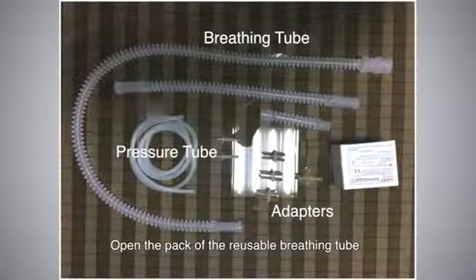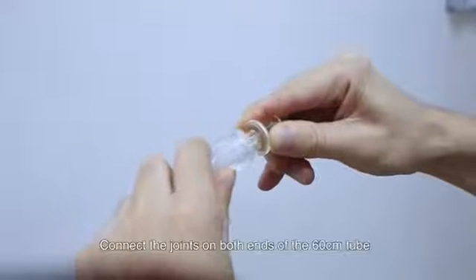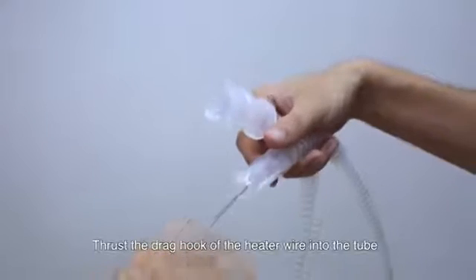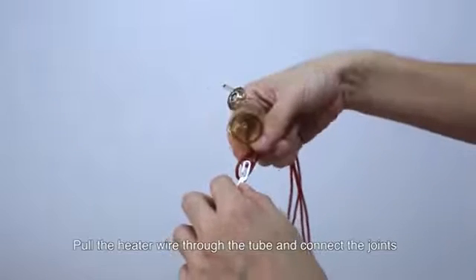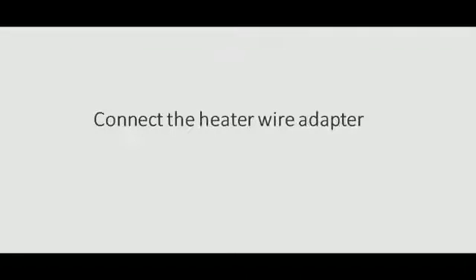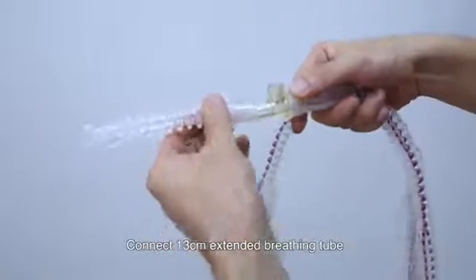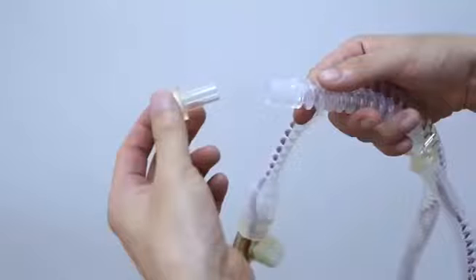Open the pack of the reusable breathing tube. Connect the joints on both ends of the 60 cm tube. Thrust the drag hook of the heater wire into the tube. Pull the heater wire through the tube and connect the joints. Connect the temperature probe. Connect the heater wire adapter. Connect the 13 cm extended breathing tube. Connect the adapter.